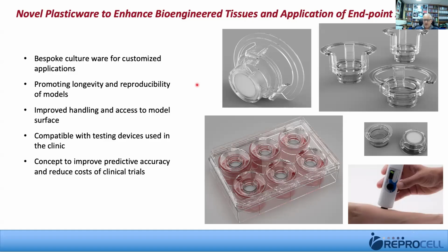They are designed for improved handling and access to the model's surface, particularly important if you're growing skin and you wish to interact with the surface of the skin model at the air interface. Some of these particular formats have been designed so they are compatible with existing testing devices used in the clinic. And I'll show an example of that shortly.